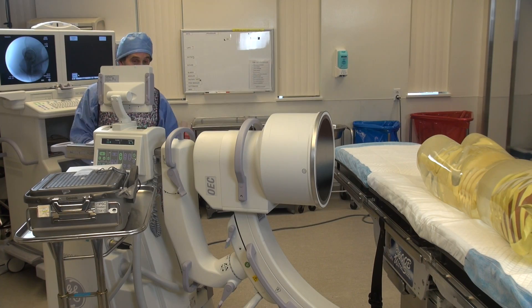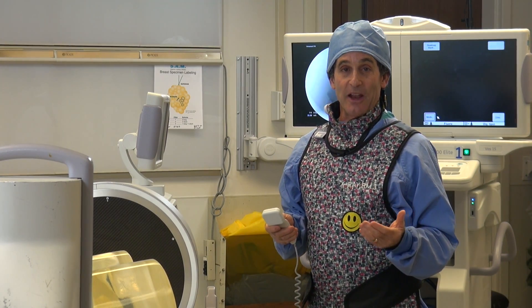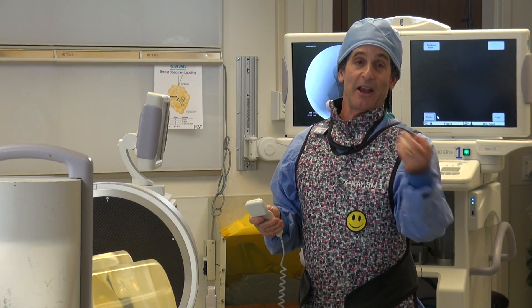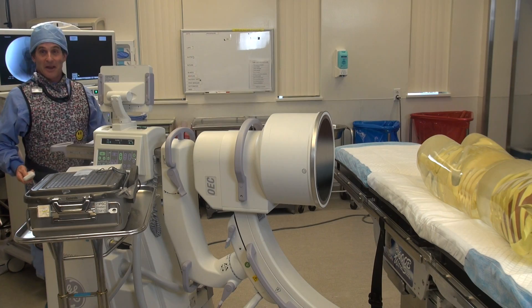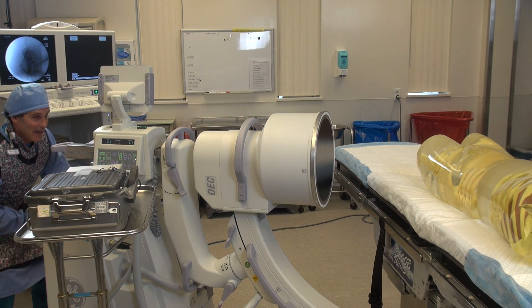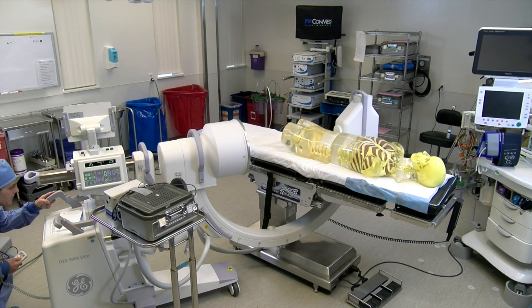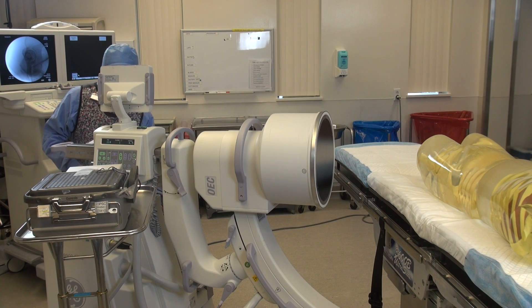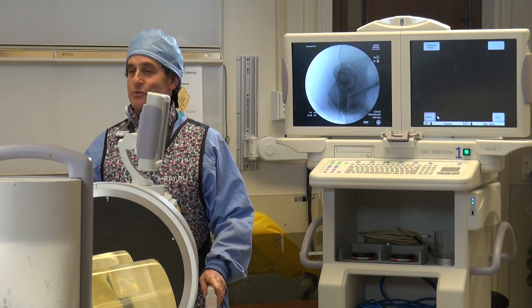I'm going to make that first exposure using the digital spot so it'll be the exact same exposure on both sides. I'm going to hide back here since I can, and I'll make that exposure. The dose is 0.0 microR, which is exactly what we expected — we've already done four or five of them.